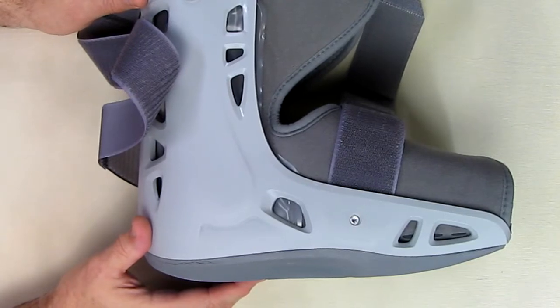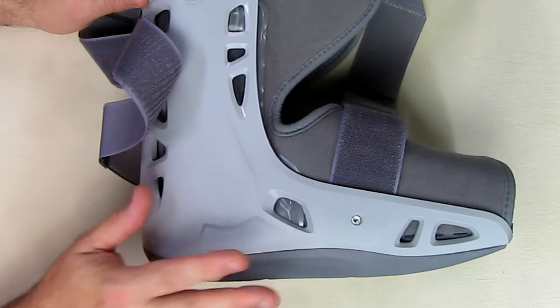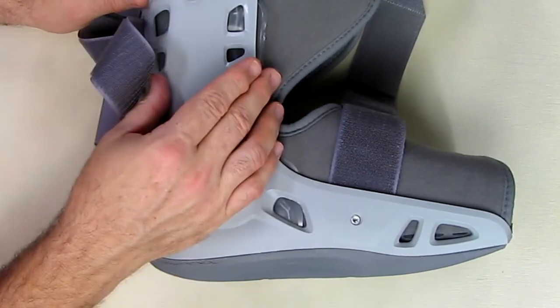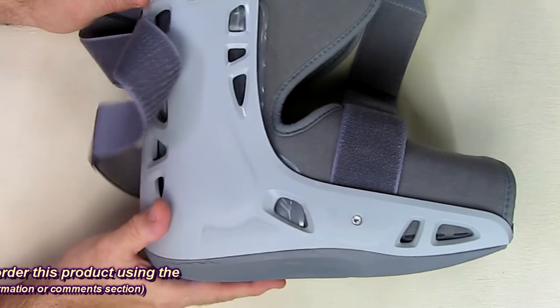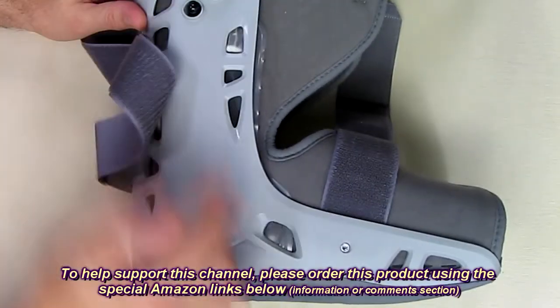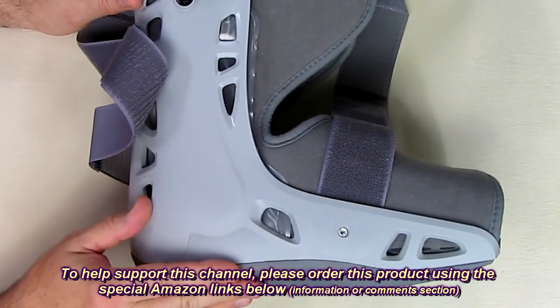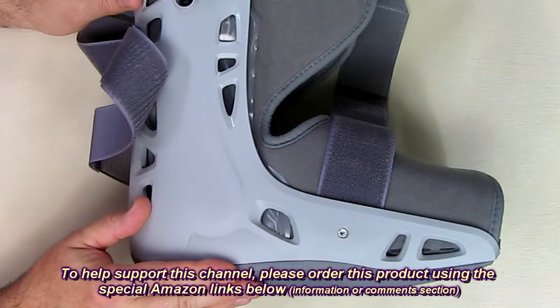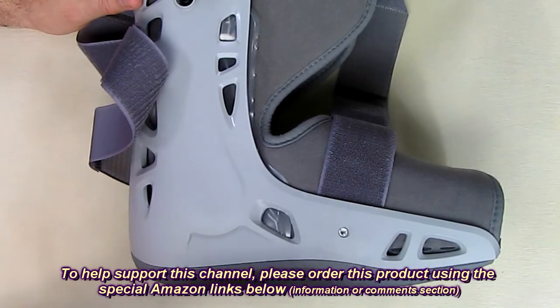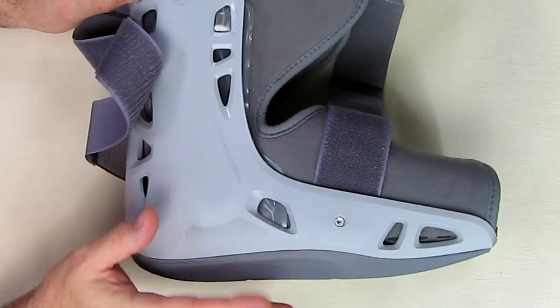After wearing this for a week, I'll tell you what I think: I like it. Just don't over-pressurize it because it's going to put some pressure on your calves, so be conservative with that. You do get used to it. In terms of the stability that this gives you, it works really well. I'm type 2 diabetic and I have a foot ulcer right now on the bottom of my foot, and this is helping me to get that pressure off so that the diabetic ulcer can heal.